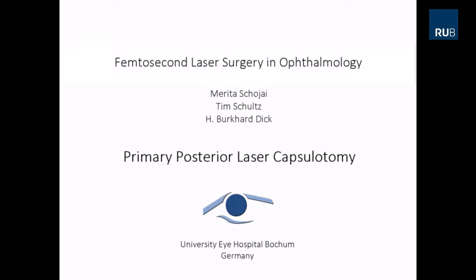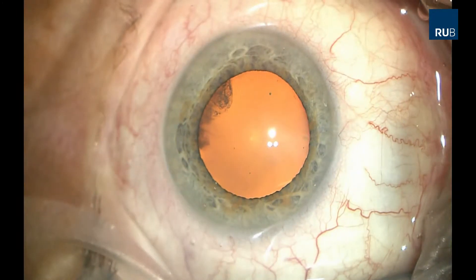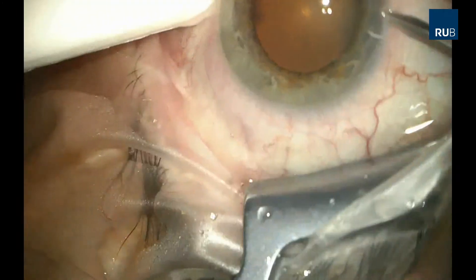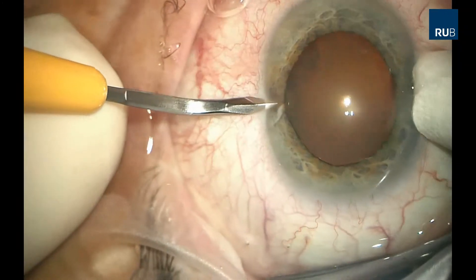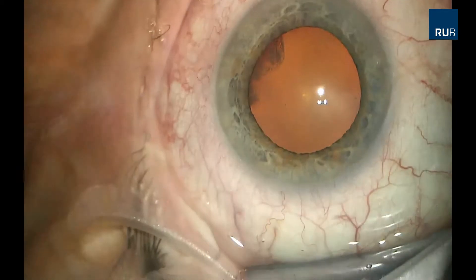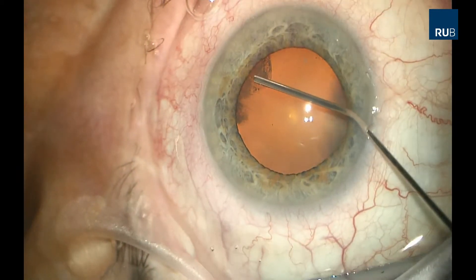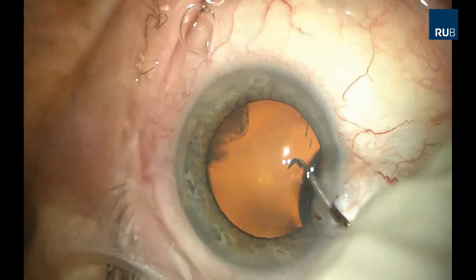First, routine manual or laser assisted cataract surgery is performed. Paracenteses are made at the three and nine o'clock position. Next, the anterior chamber is filled with OVD and an anterior capsulorhexis is performed.